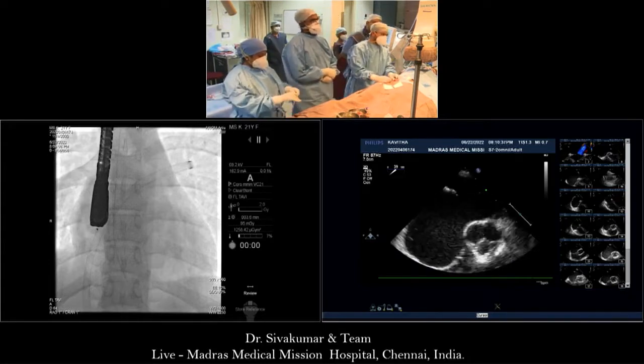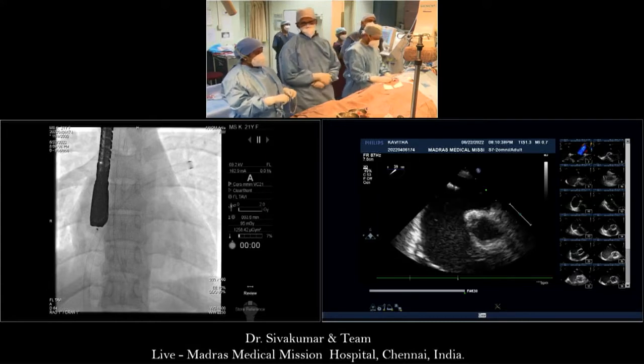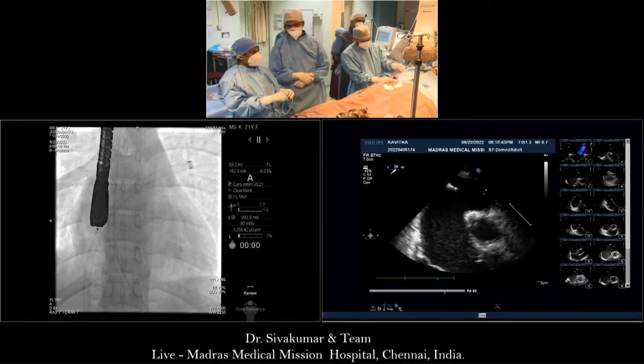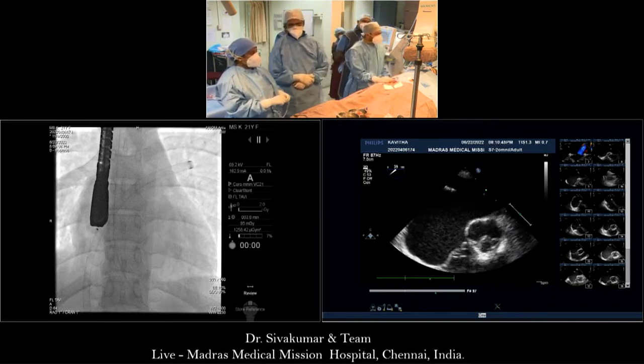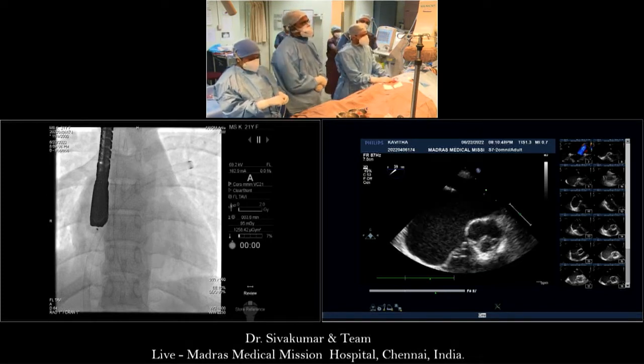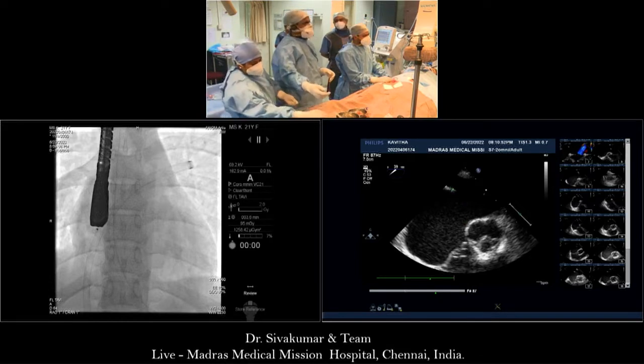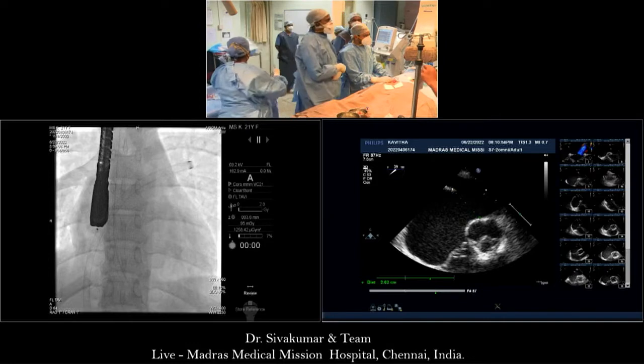In atrial diastole, you have to measure in atrial diastole. I don't have an ECG connector. The atrium gets bigger, you know. Okay, that's it. Measure that. This is a great case, a fantastic case. Very good, Shiva, this is a fantastic case. Thanks for choosing this.